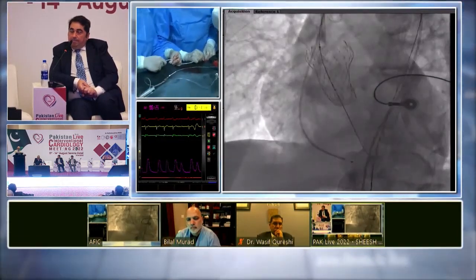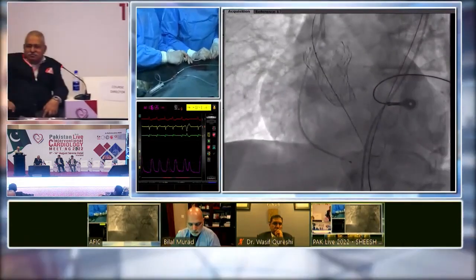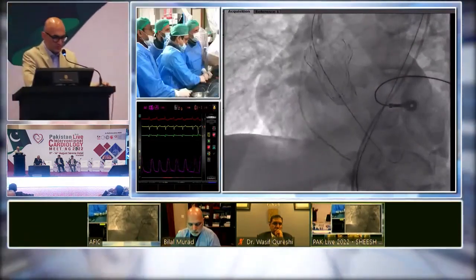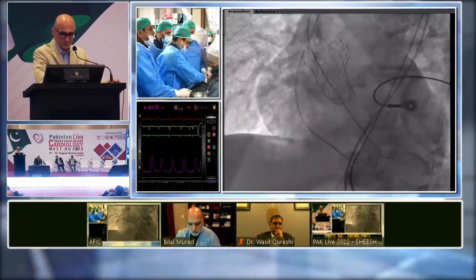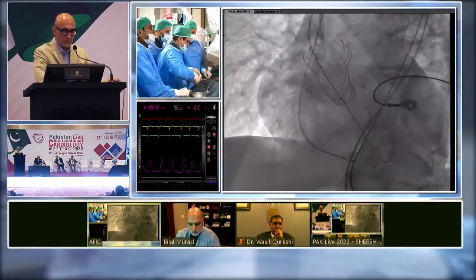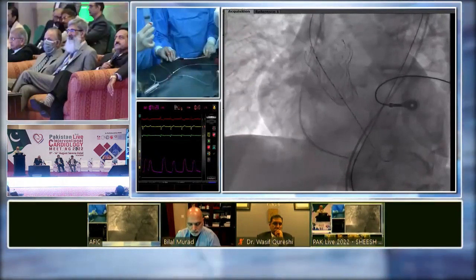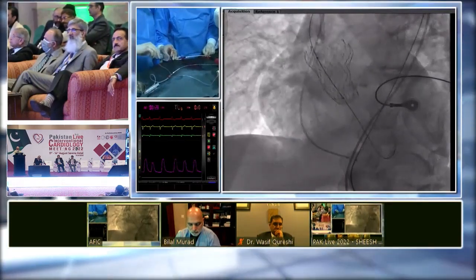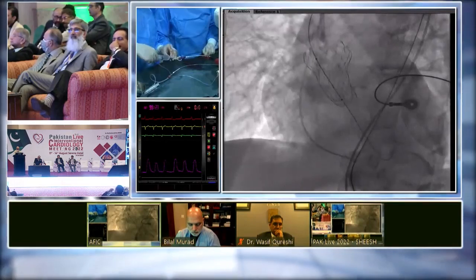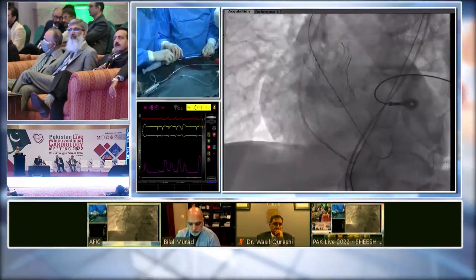You see that they're doing post-dilatation. Asad, what size balloon did you take for the post-dilatation? We are taking a 26, which is the mean diameter. What was the reason for post-dilating here? We tried to do a 22 pre-dilatation, but that balloon burst because of the heavy calcium.